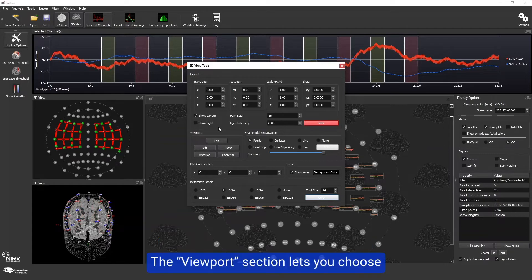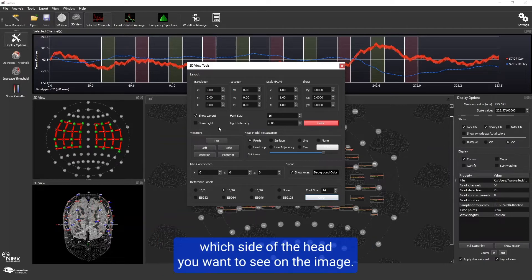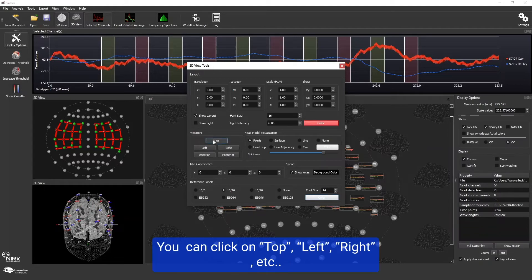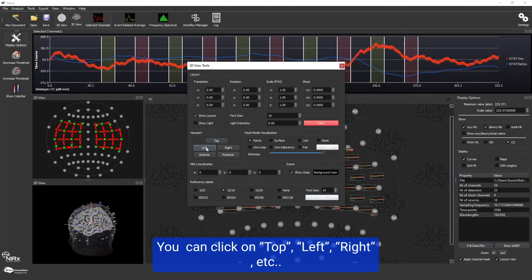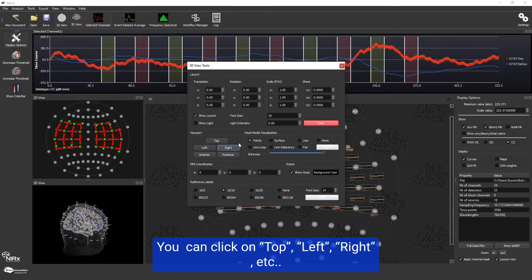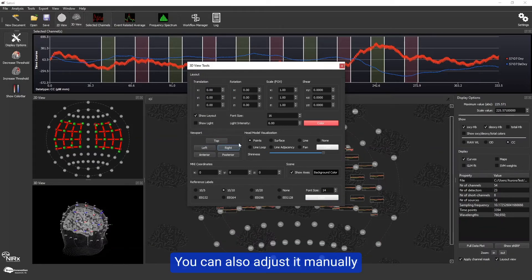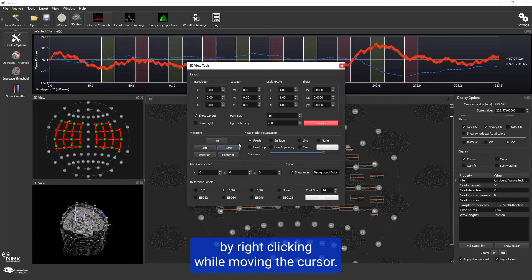The viewport section lets you choose which side of the head you want to see on the image. You can click on top, left, right, etc. You can also adjust it manually by right-clicking while moving the cursor.